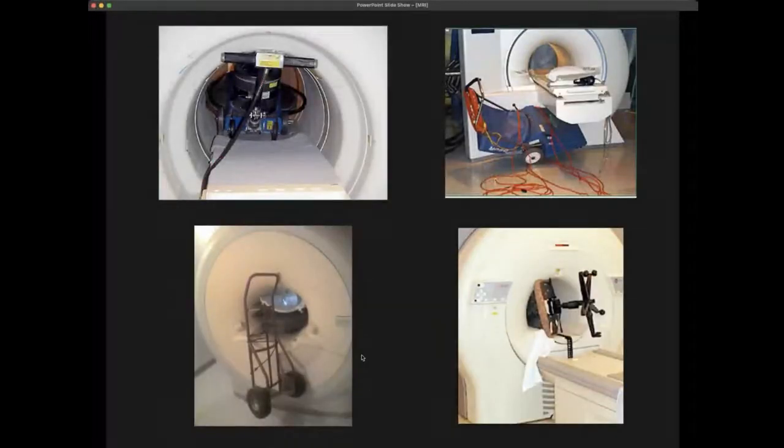But the biggest safety issue, where most of the injuries and even deaths have happened with the MRI scanner, is bringing foreign objects into the scanner room with such a large magnetic field. Right? As I told you, this 1 Tesla is not even the strongest magnet that you can buy, and you put things in, that's what happens. Here you see examples where a cleaner brought in a cleaning machine, or a worker brought in a little trolley, or even a seat was rolled in for convenience. And you see that these are really, as projectiles, immediately attracted by this enormous magnet.